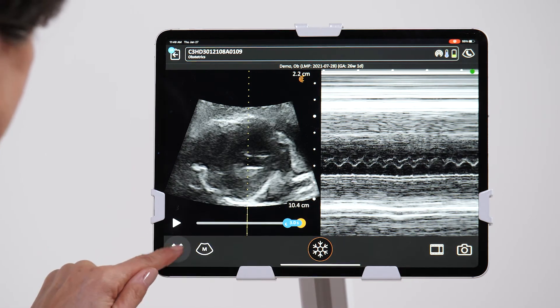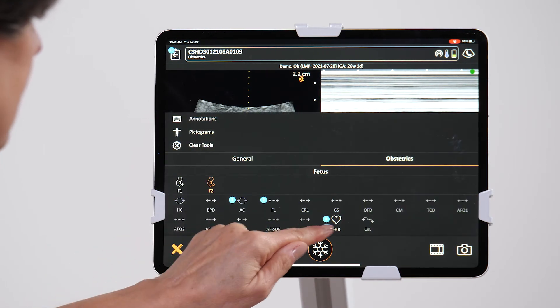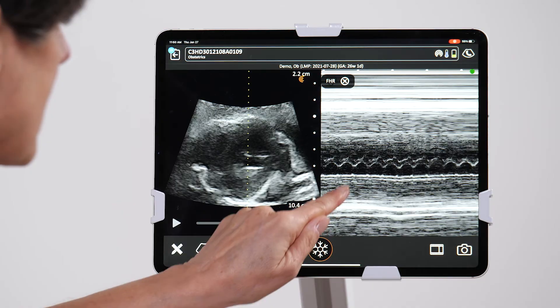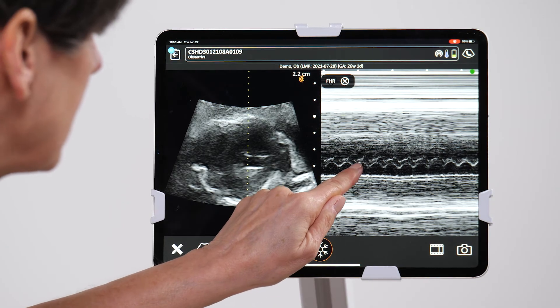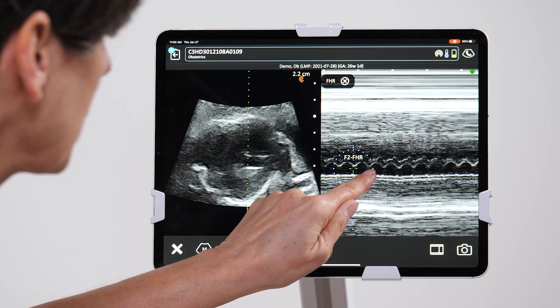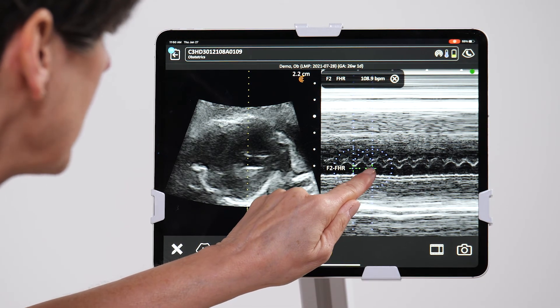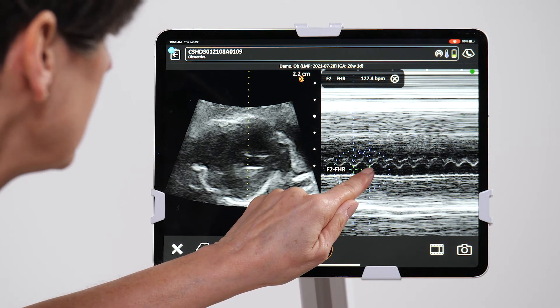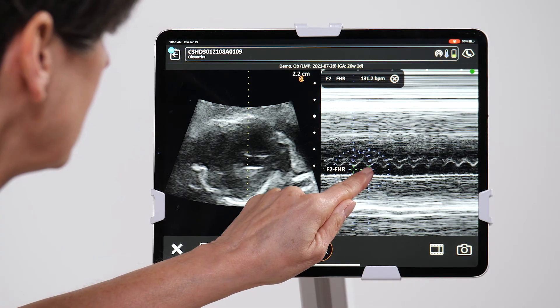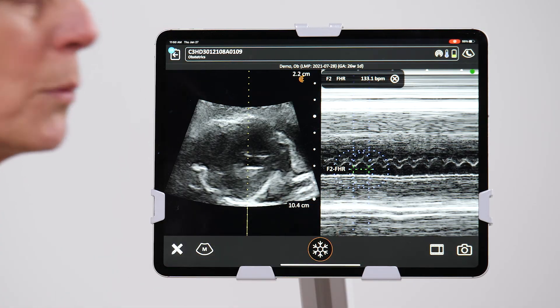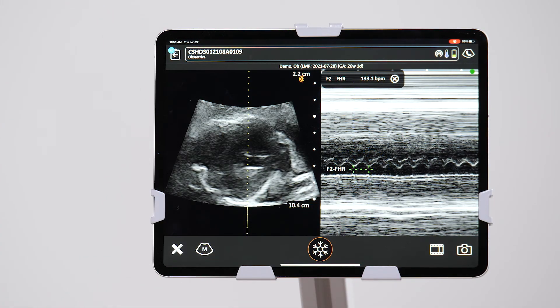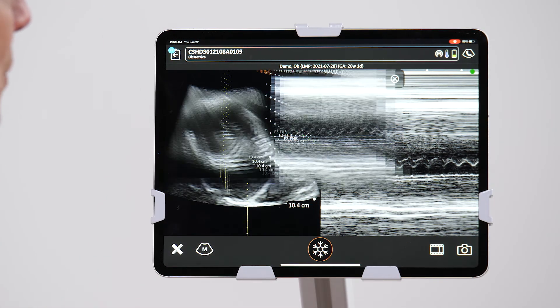Freeze the image, select heart rate, and again we're going to measure the baby's heart rate just one cycle. And that's showing me 133 beats per minute. Save it to the report.